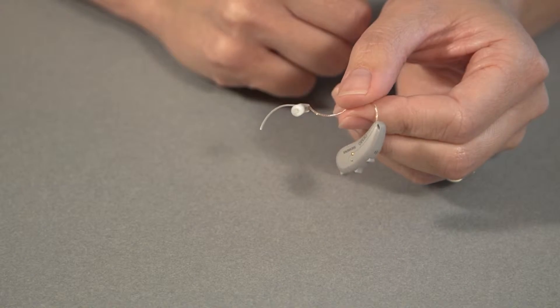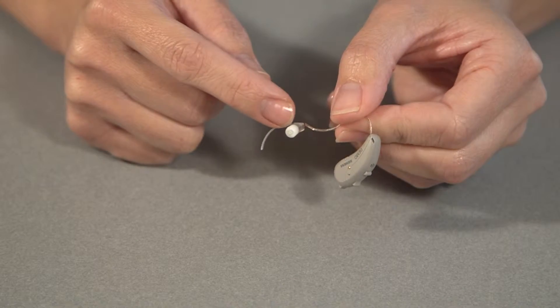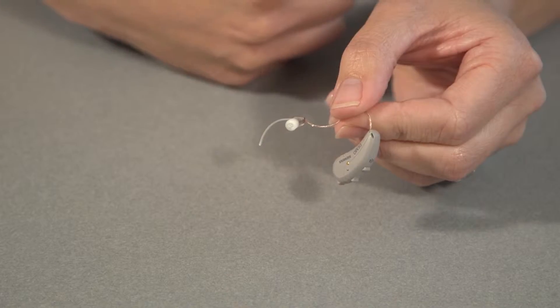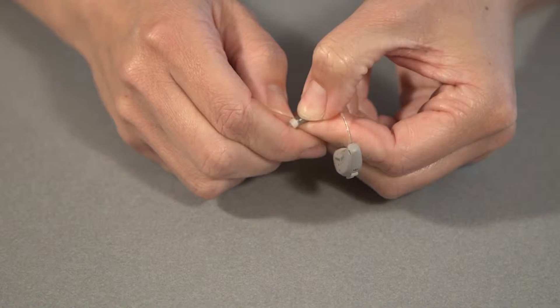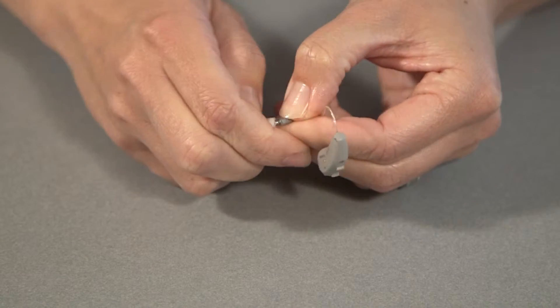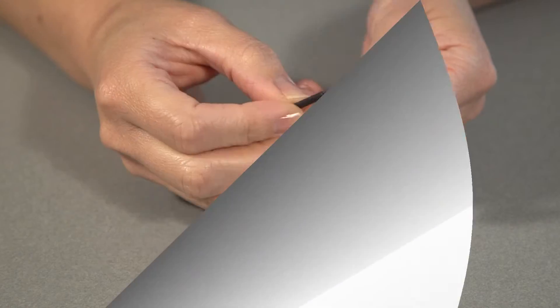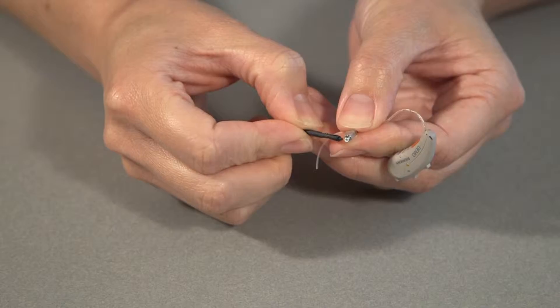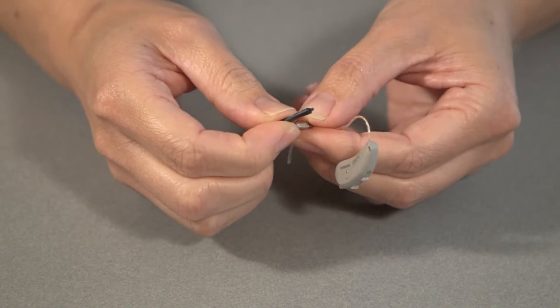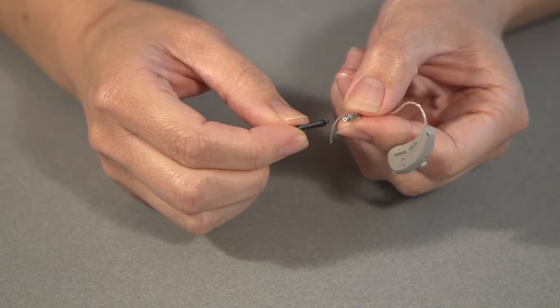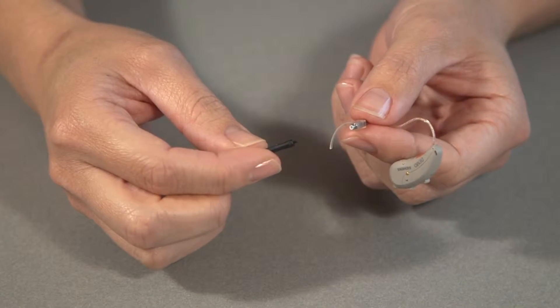The next thing you want to do is replace the dome and the wax trap that's behind the dome. In this case it's a click dome so you want to sort of get your nail behind the dome and just flick it off like that. The wax trap is the little white ring that was behind the dome and that is there as sort of a second line of defense to prevent wax from getting into the receiver.